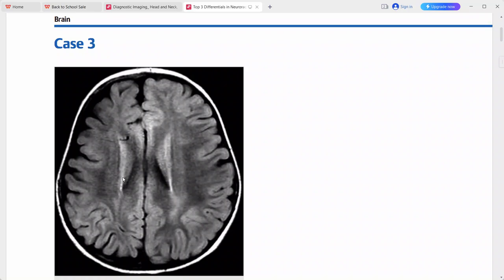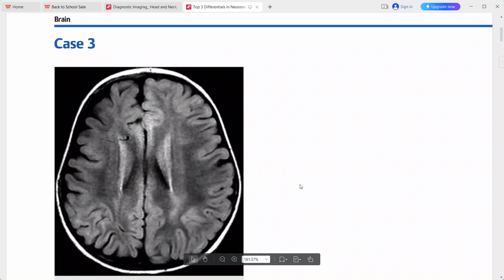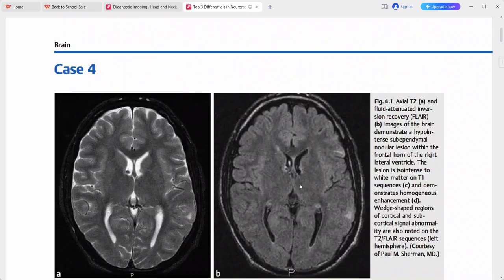The key imaging finding is asymmetric cerebral hemispheres, with the right smaller than the left. This is a case of Sturge-Weber syndrome. Differentials for asymmetric cerebral hemispheres include normal variant, encephalomalacia, Dyke-Davidoff-Masson syndrome, hemi-megalencephaly, and Rasmussen encephalitis.